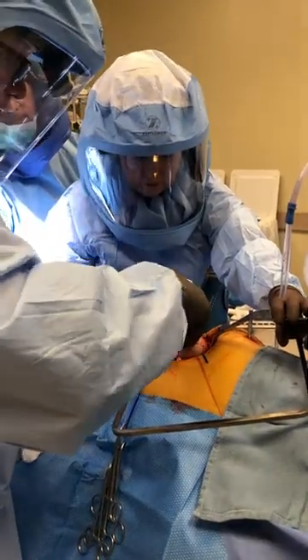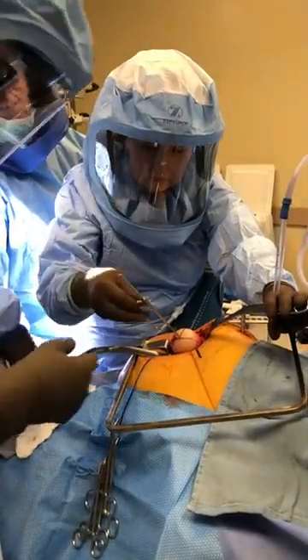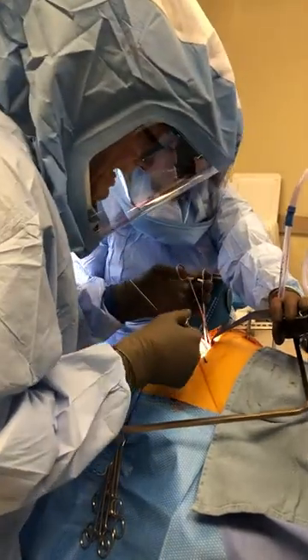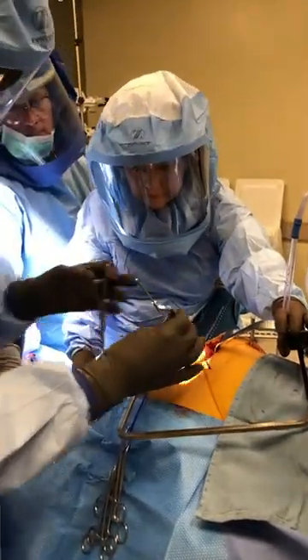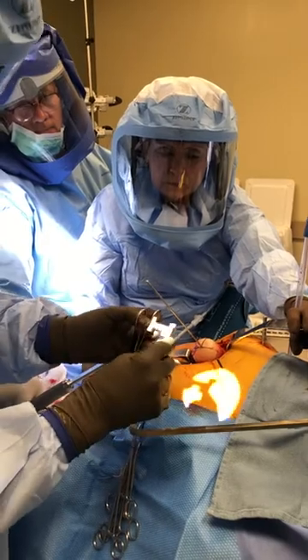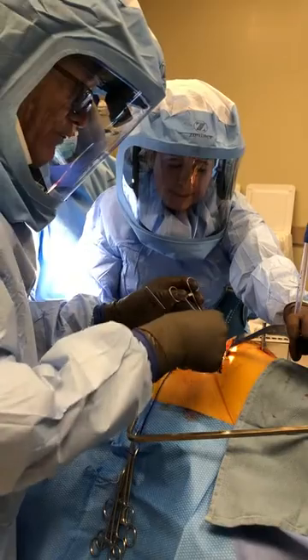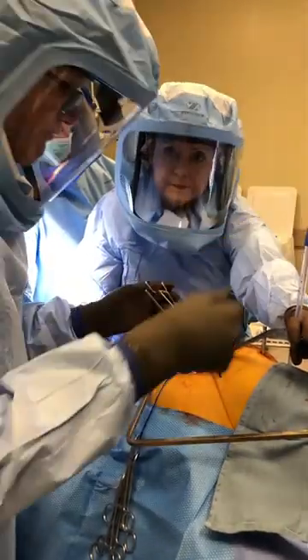And disassemble, and now we check. This is the 44 check guide, because we're sizing for a 44 implant, but we can go to a 52.